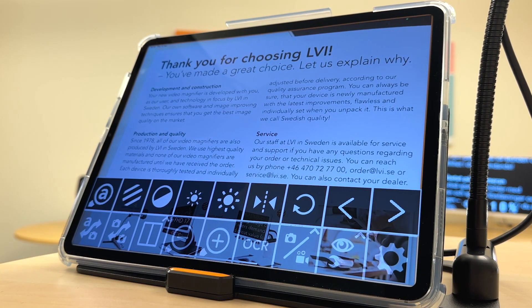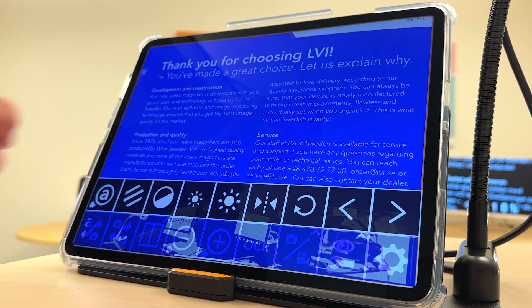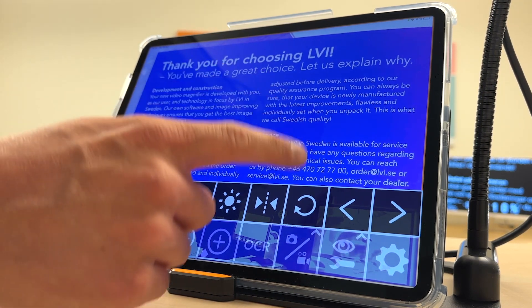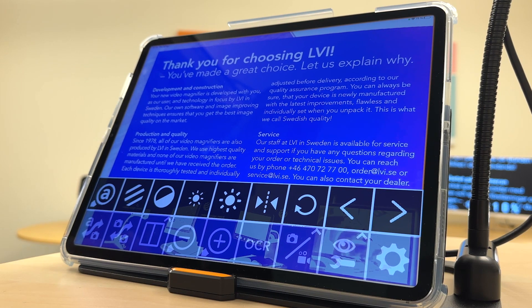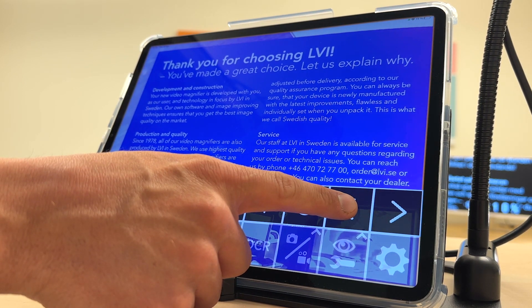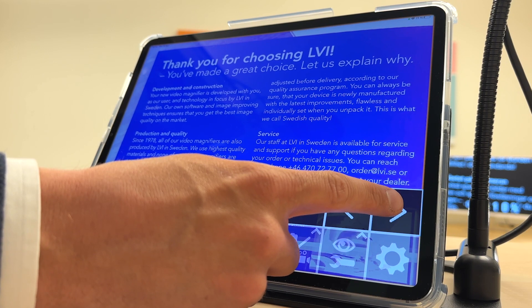We have many of the standard video magnification features such as changing the high contrast, adjusting the brightness, as well as the iPad cameras mirror mode, and the ability to rotate the image if you prefer to have the external camera on your left side. You can also add various maskings and guiding lines to enhance your reading.